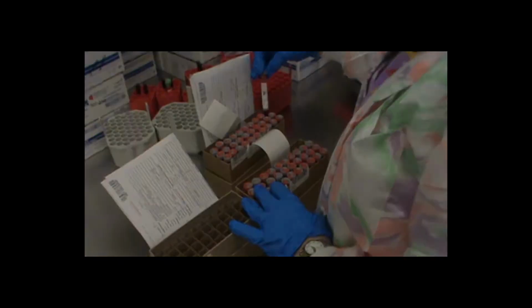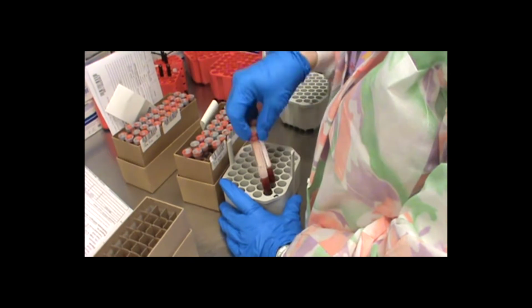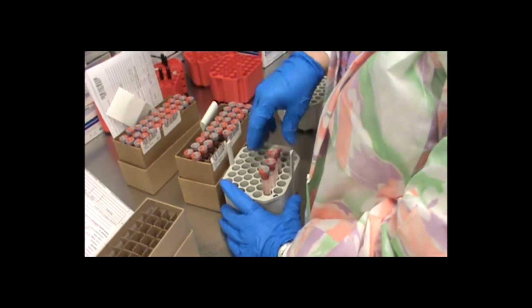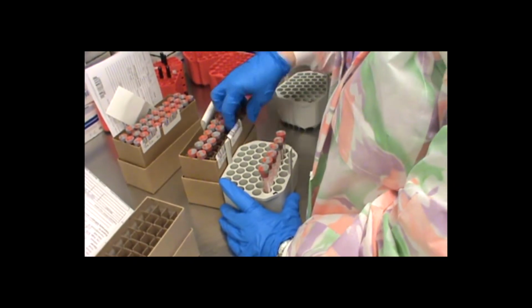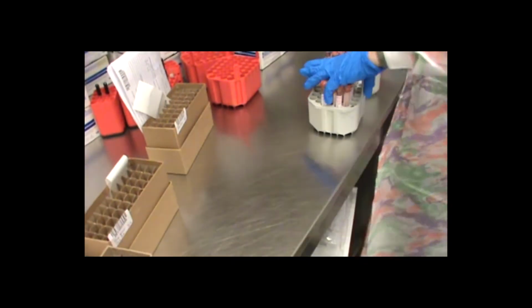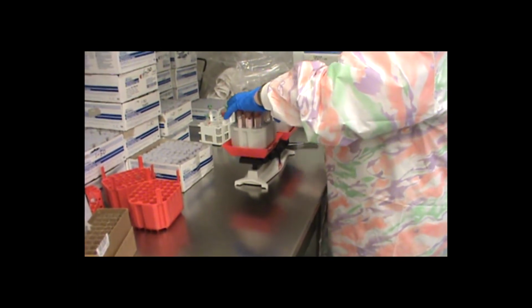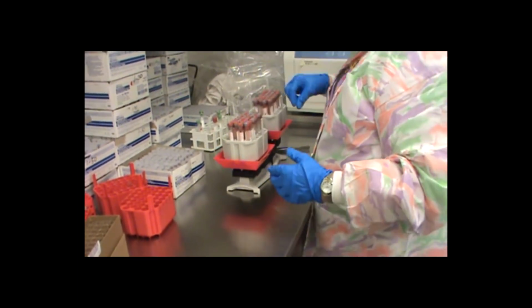Serology mailroom. In the serology mailroom, the boxes are opened and they make sure the samples are numbered in plastic snap cap tubes, such as a falcon tube. If they are improperly submitted or in glass tubes, they must be centrifuged again and poured off under the fume hood. The diagnostic lab policy is to not allow glass tubes to leave the mailroom because of the increased cross-contamination of the rubber stopper tops.